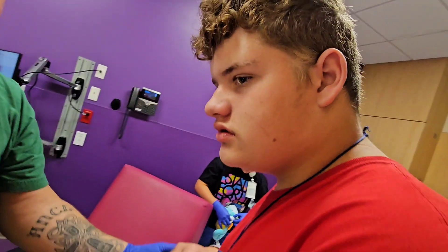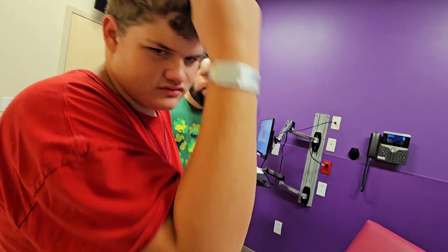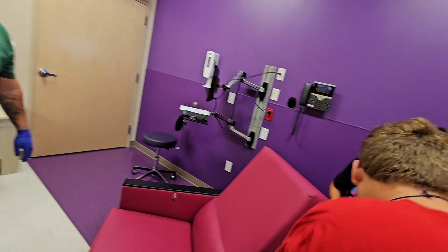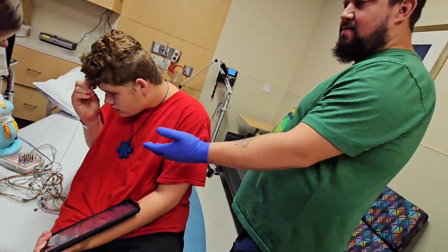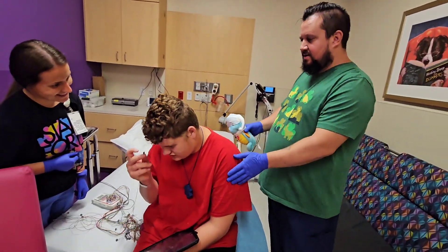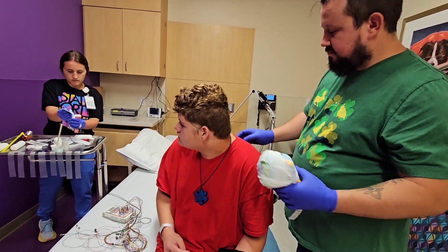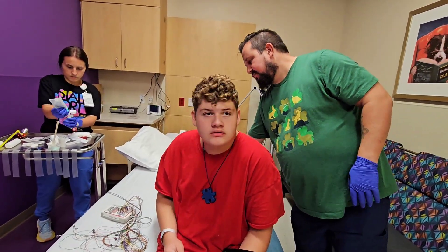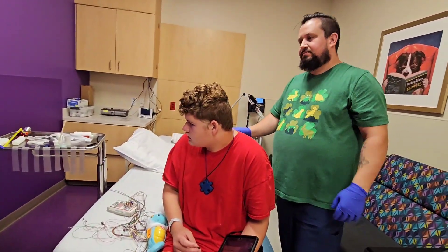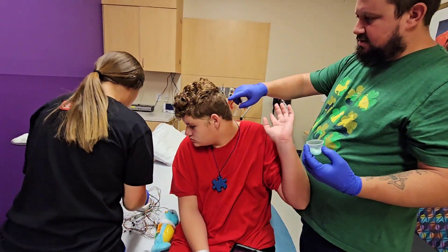It's JJ's turn. Have a seat, my little guy. So you'll sit right here so she can play with your hair and you can show me some music, okay? She'll look at your curls and play with some curls too. Have a seat — would you rather sit here, you feel more comfortable sitting here? Okay buddy, that works. Yeah, that's awesome. He's got this, and no hurting, it's not gonna hurt one bit. Hey, if it hurts you JJ, we'll leave, okay? If it hurts you, we'll leave.